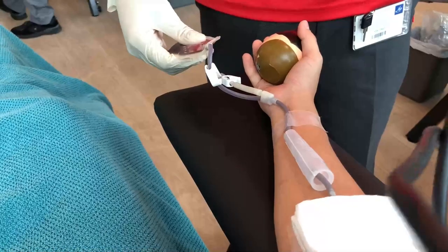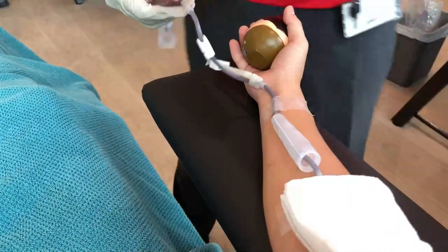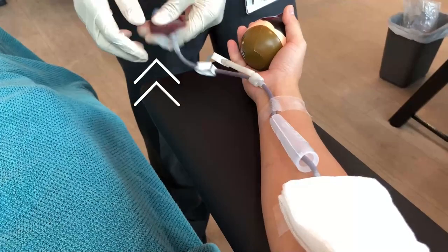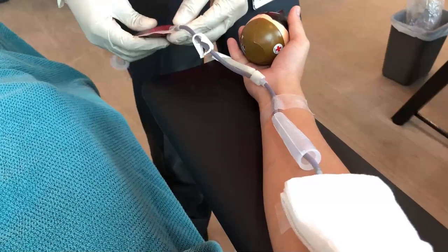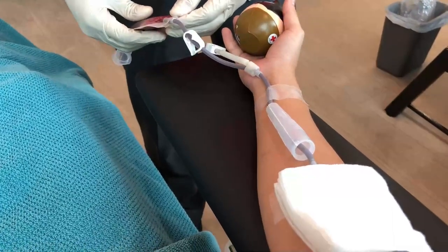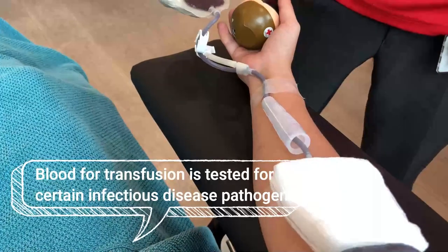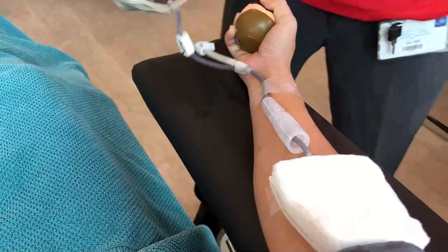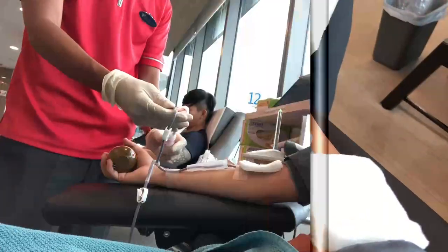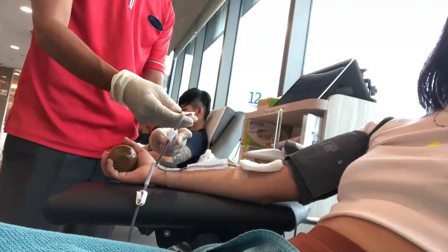Blood starts pouring out right after he inserts that needle. Look — that bag's already filled up. But that bag isn't the donation bag; the donation bag's much bigger. That little bag is for sampling because they want to take some blood samples and test it in the labs just to make sure that your blood is suitable for donation.